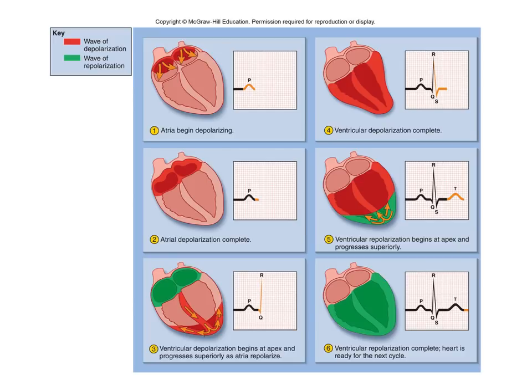During the QRS complex, you can see the green, the atria repolarizing, but you can see with the red, the ventricles starting to depolarize. That leads us to the top of the next column, where you have your ST segment.